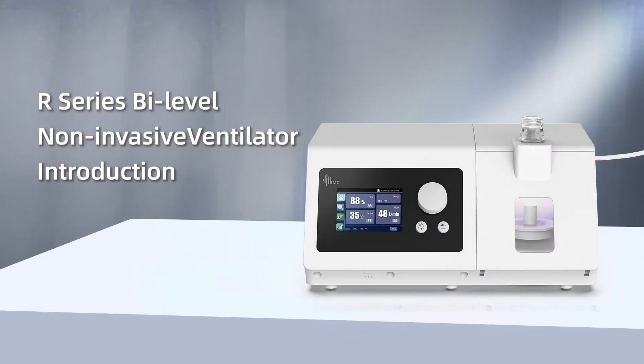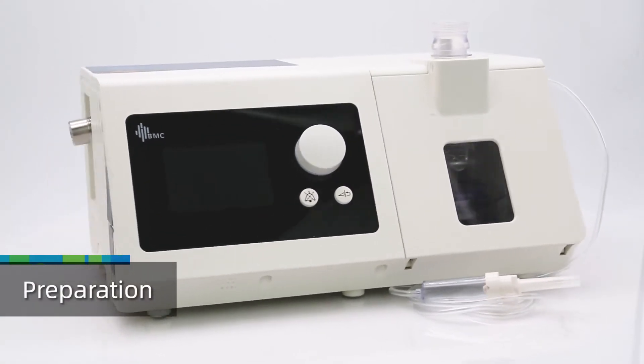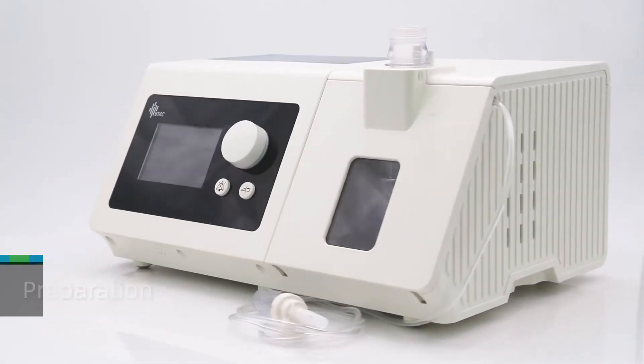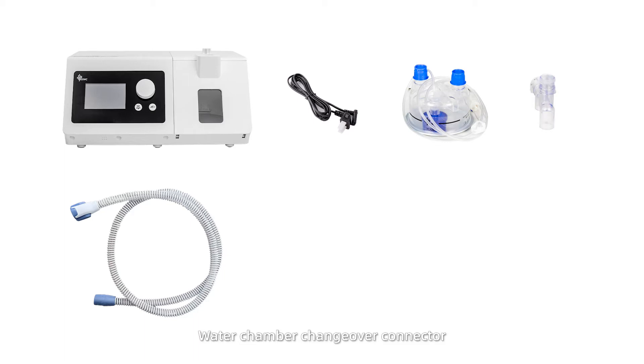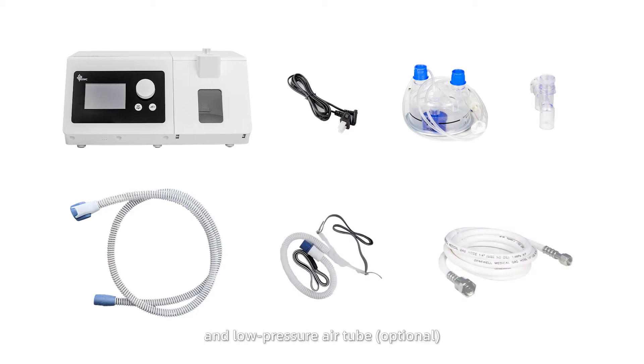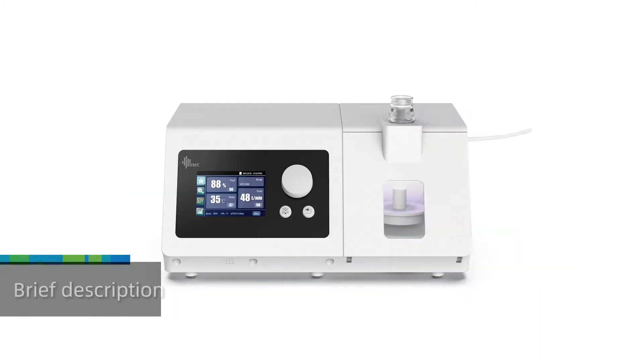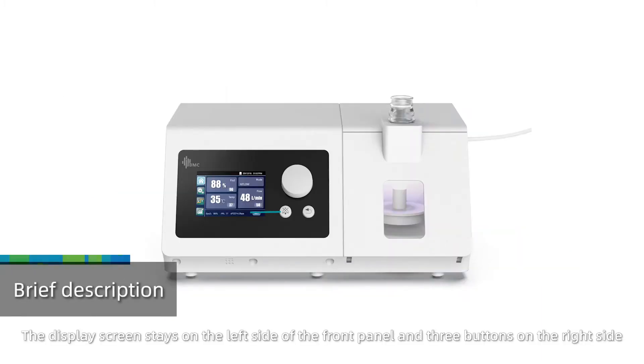R-series bi-level non-invasive ventilator introduction. Preparation: Take out the main device, heated tube, power cord, water chamber, changeover connector, patient interface, and low-pressure air tube. Brief description: The display screen stays on the left side of the front panel.